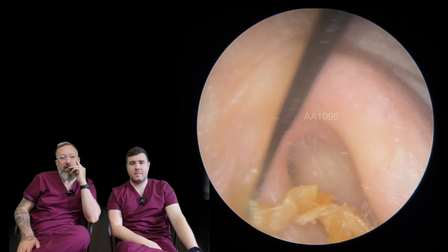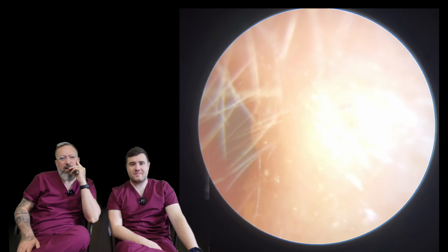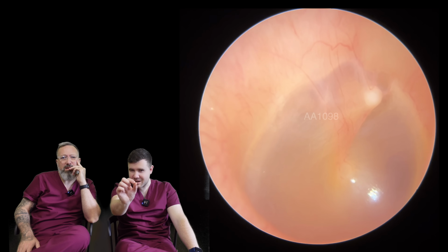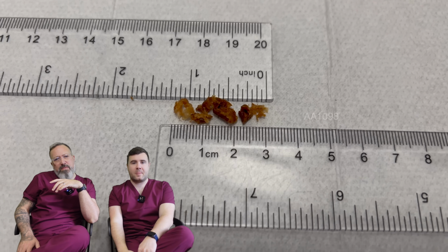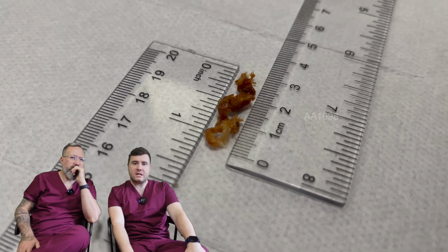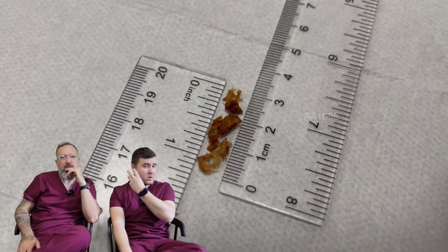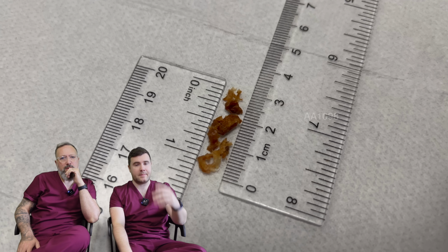There we go. Go on. There we go. Look at that bad boy. Yeah. Wow, that's looking a lot better, isn't it? Look how spotless. Look at that light reflex. Yeah. There's like two of them there. That is really shiny. Inch and a quarter. Yeah, got 3 centimeters there, so that was a big relief for the patient. Obviously, that one side especially was causing an increase in the tinnitus. But yeah, we've managed to do it. Well done.